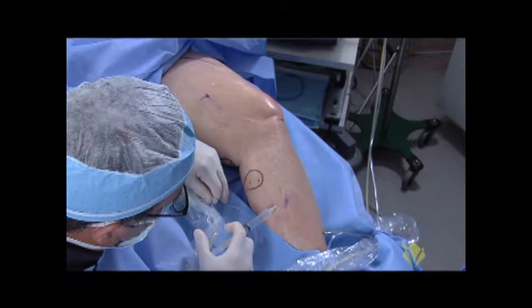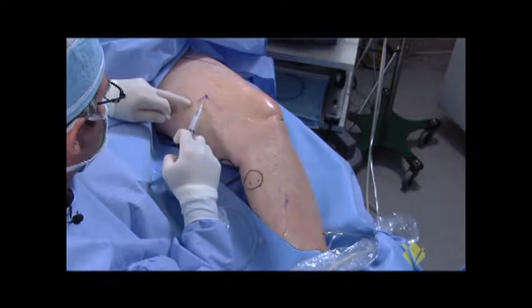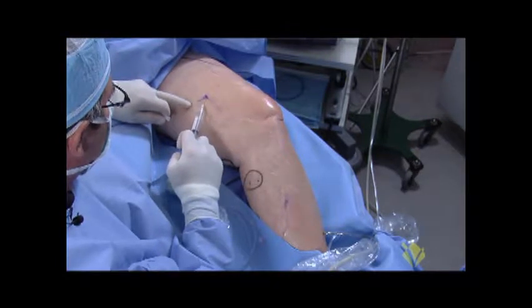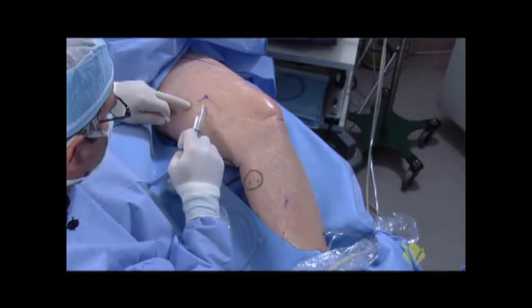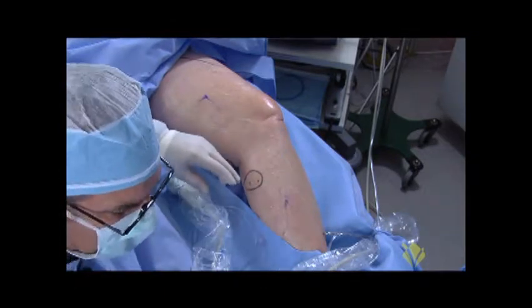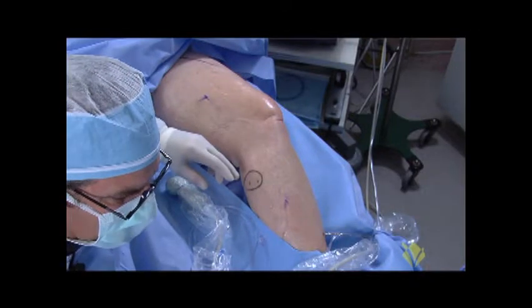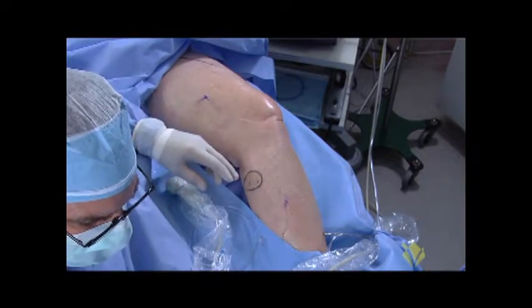I've marked the entry point again after reinvestigating. I'm going to numb up the skin here for the entry point — this does hurt a little bit, I'm sorry about that. I'll create a small skin wheal up top as well, and then the next step will be to gain access to the veins using the seven French micropuncture kit.